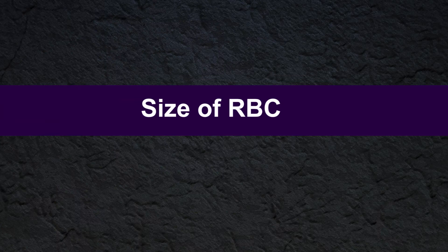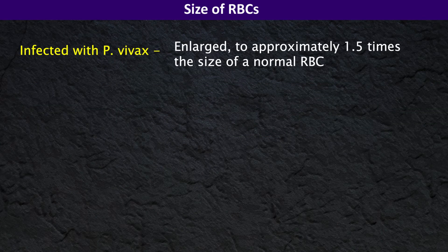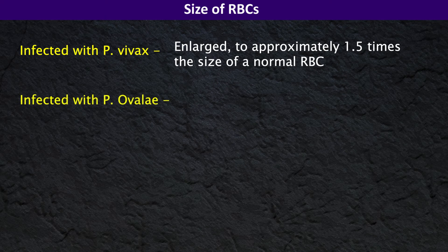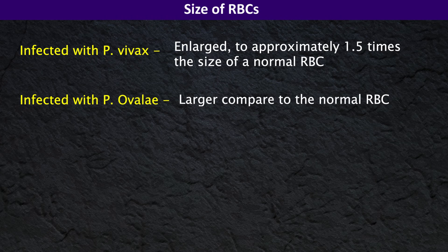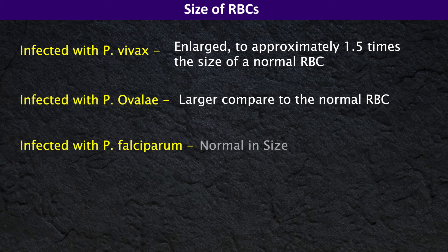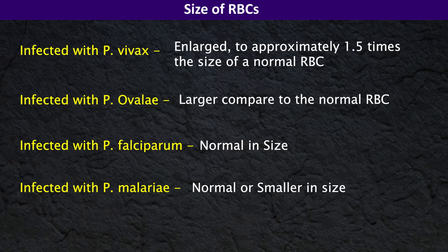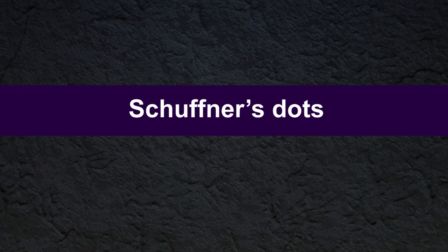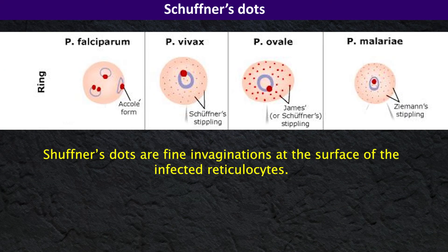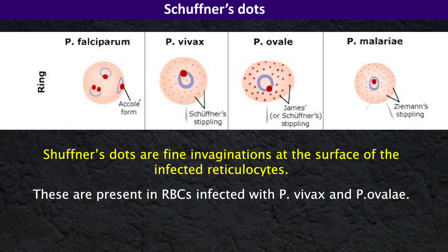Red blood cells infected with Plasmodium vivax are enlarged to approximately 1.5 times the size of normal red blood cells. Red blood cells infected with Plasmodium ovale are also larger compared to normal red blood cells. Red blood cells infected with Plasmodium falciparum are normal in size, and red blood cells infected with Plasmodium malariae are normal or smaller in size. Schüffner's dots are fine invaginations at the surface of the infected reticulocyte, and these are present in red blood cells infected with Plasmodium vivax and Plasmodium ovale.